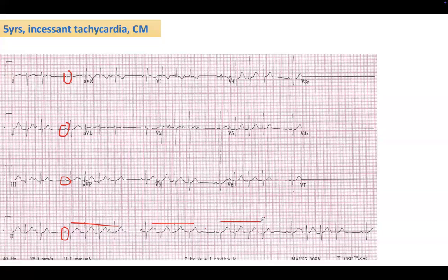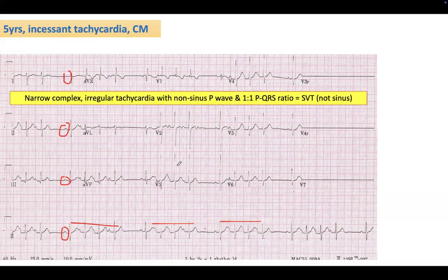So that's the behavior of a focal atrial tachycardia. The P waves are not identical to the sinus P waves. I mean, they're very similar, but not identical, because the origin of that patient's atrial tachycardia was near the sinus P wave origin. If you look at lead 1, for example, the tachycardia P waves are very tiny, very small versus a bigger sinus P wave. Anyway, so this is how I would describe the ECG.